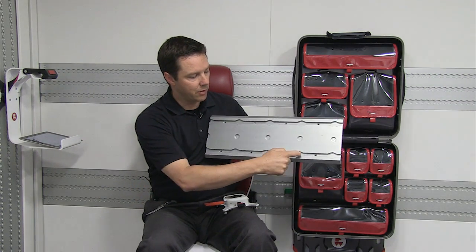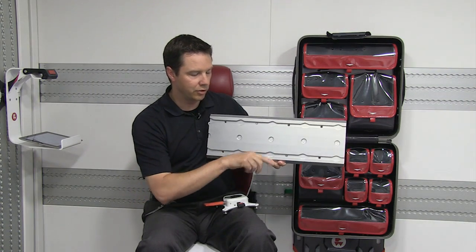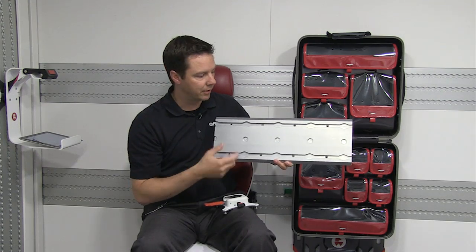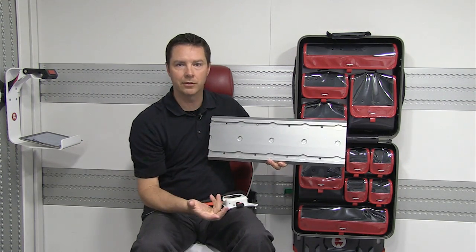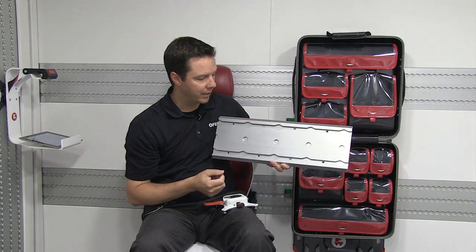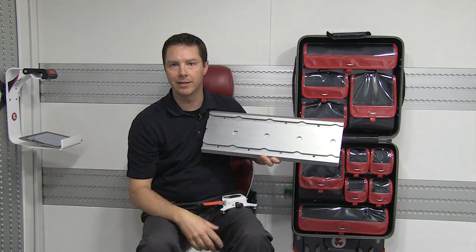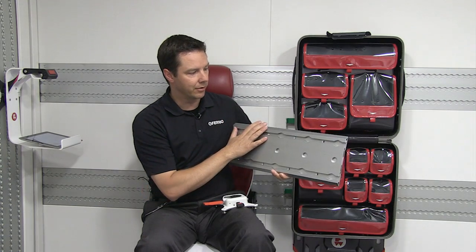Every one of these zones are called drop-in zones, and it's an area for fluids to drain out. So if you were to hose down the interior of your ambulance, you could just wipe out these tracks, but all the fluid is going to drain out of these drop-in zones so that it doesn't collect and harbor pathogens in the track. They sell brushes that can go right down these things and clean them out very easily if someone vomited or whatever, got it dirty.